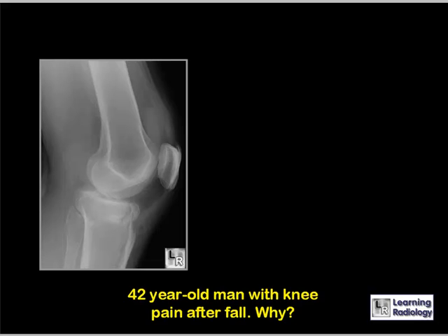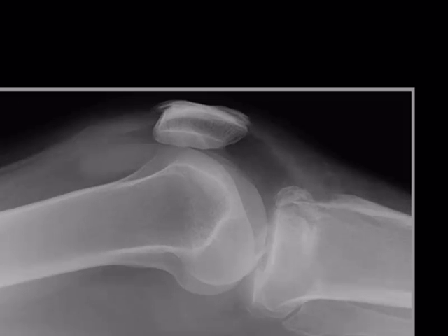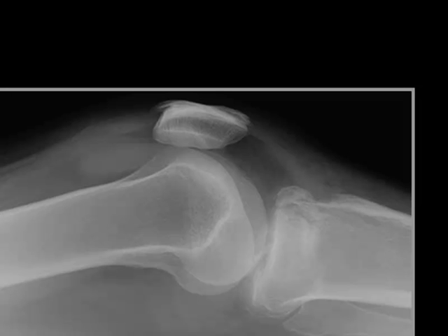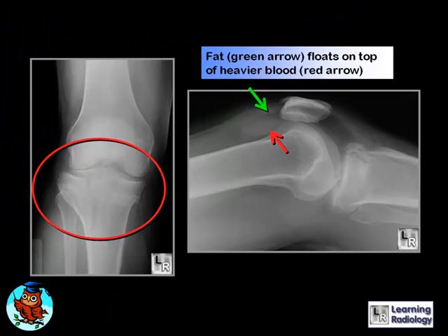This is a 42-year-old man with knee pain after a fall. On the across-the-table lateral view, there is a fluid-fluid level in the suprapatellar bursa representing fat floating atop blood (red arrow) — this is called a lipohemarthrosis, which almost always indicates a fracture allowing fat from the marrow around the knee to percolate into the joint space. The red circle shows there was a fracture of the proximal tibia.